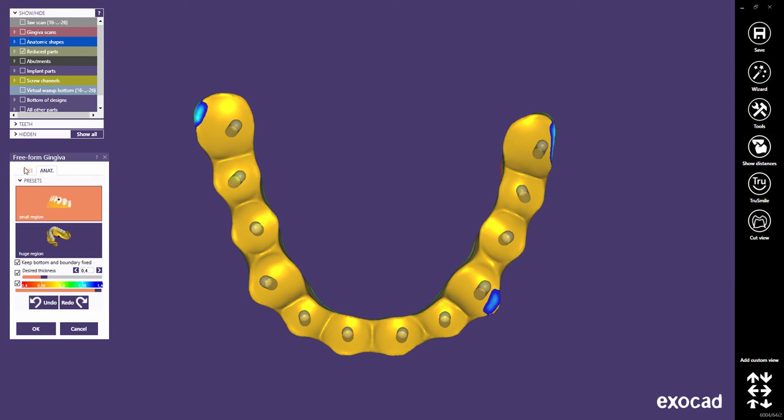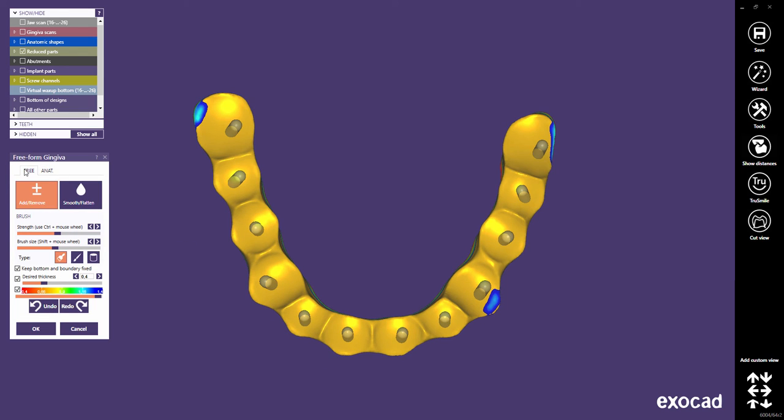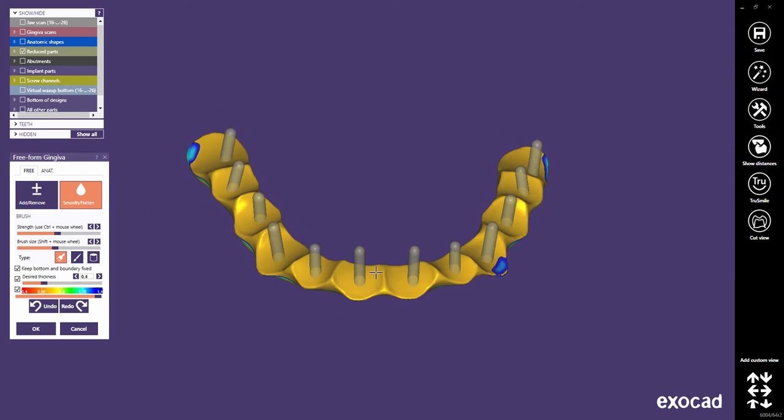Choose Free and Smooth Flatten to smooth the major connector's design.